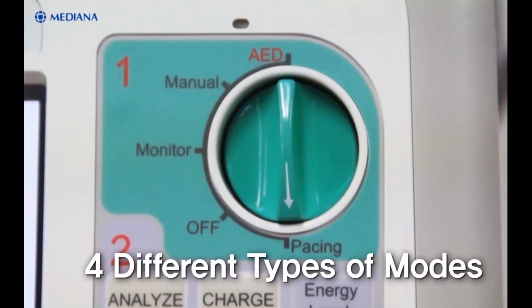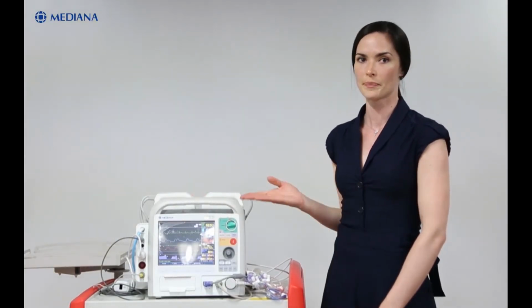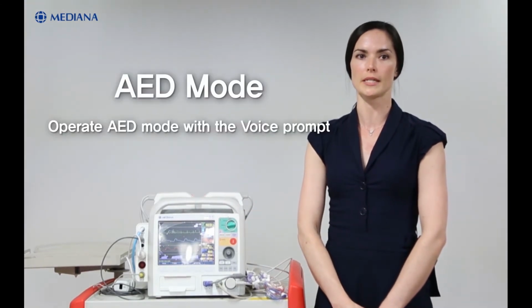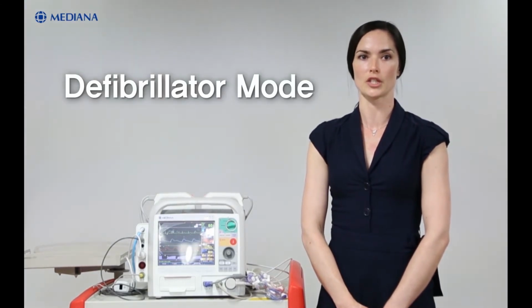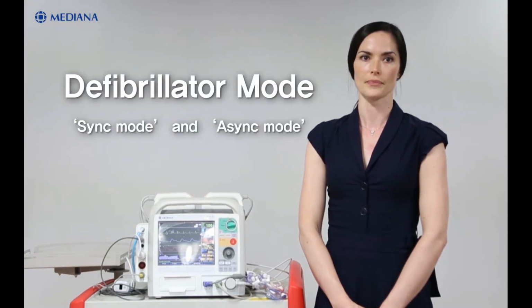D500 has 4 different types of modes: manual mode, AED mode, monitoring mode, and external pacing mode. And we can select the desired mode by rotating this mode select knob. In AED mode, you can actually operate AED mode with the voice prompt. In defibrillator mode, you can operate the defibrillation with 2 types, sync mode and async mode.